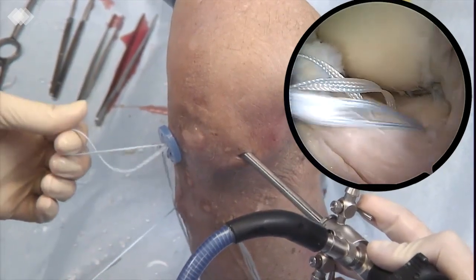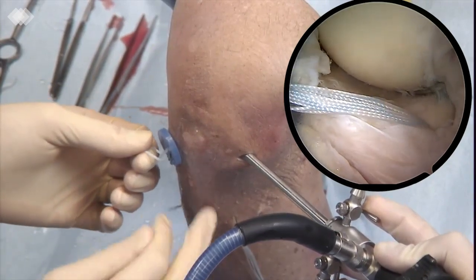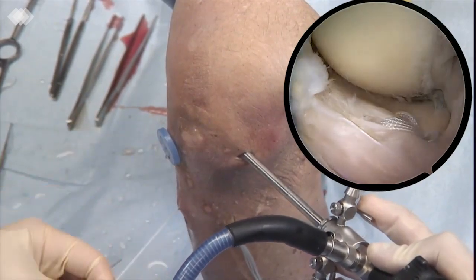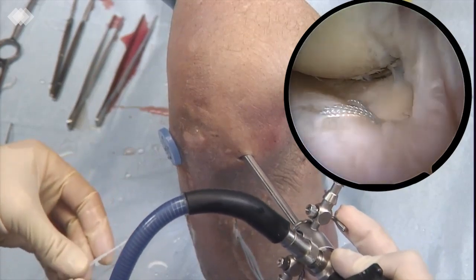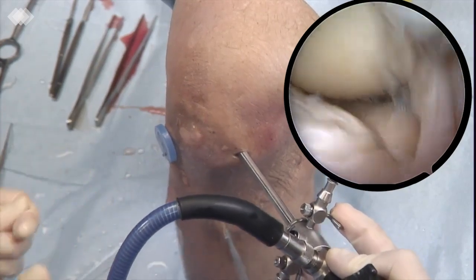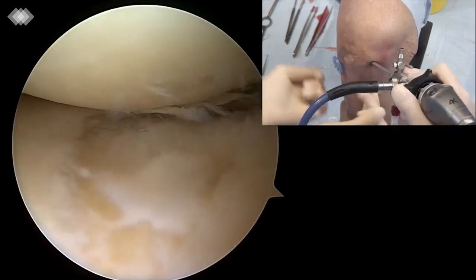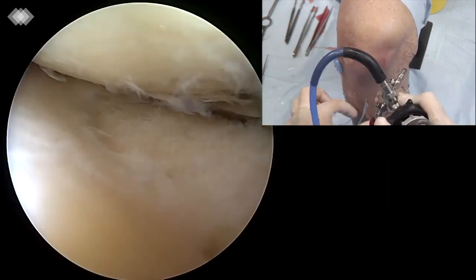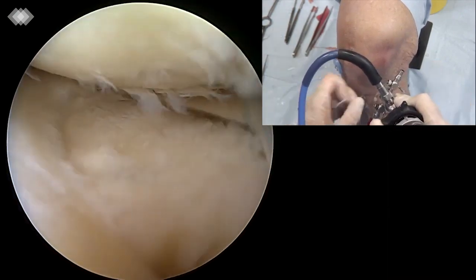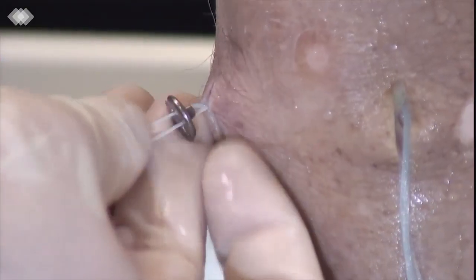The suture tape is then passed through the tibial tunnel and the joint space opening is observed. The mid portion of the extruded meniscus moves to its original place.